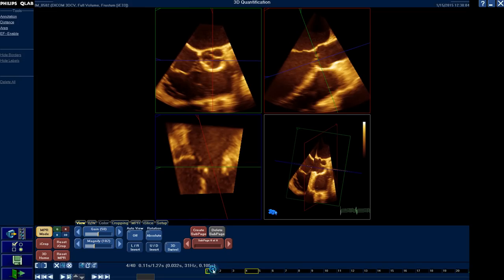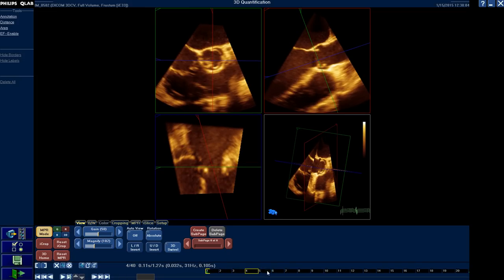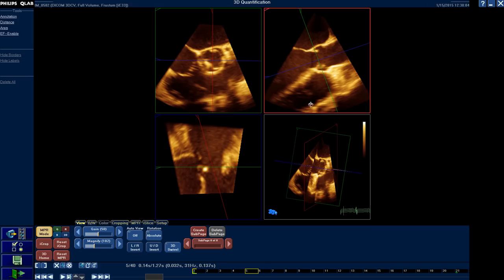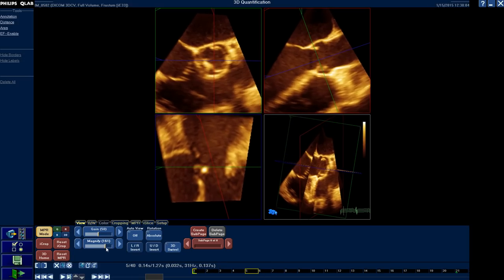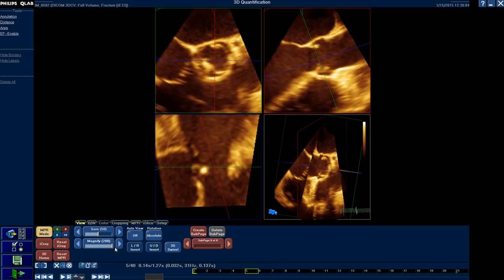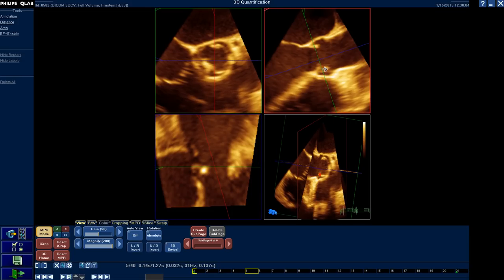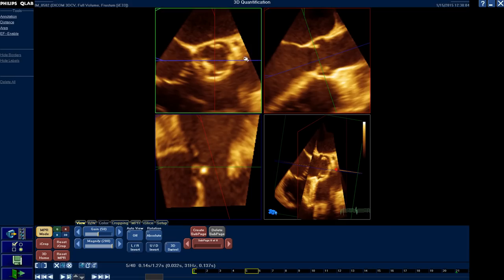We should choose the systolic frame, like this one. We can magnify in order to make the dimensions more clear and to decrease the error. As you can see now, I have a long axis view for the LVOT, aortic valve, sinuses, sinotubular junction, and ascending aorta.